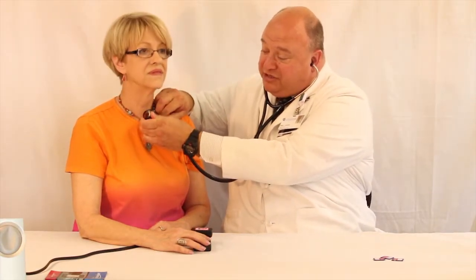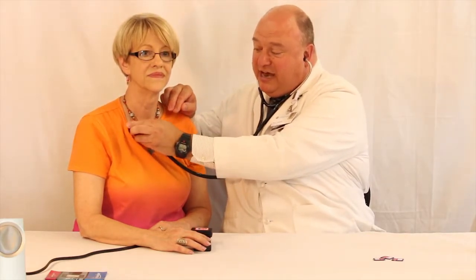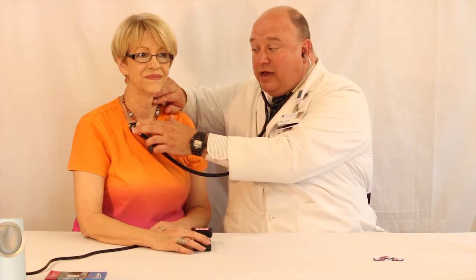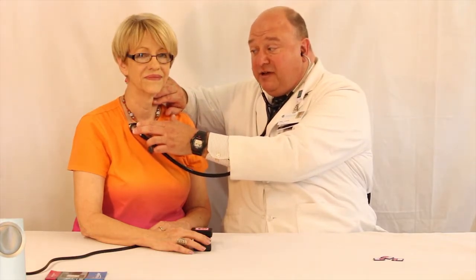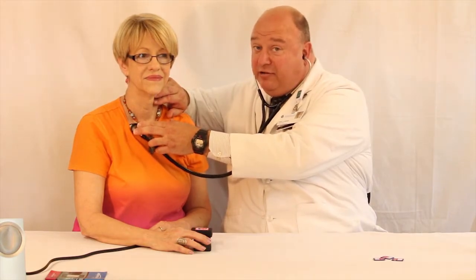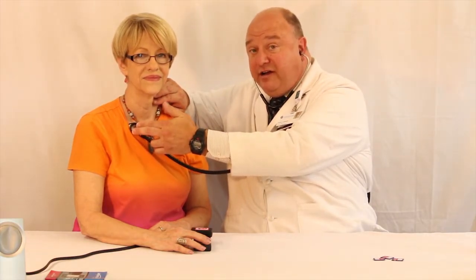Now I go to the other side of the chest. Of course, we would never examine a patient through clothing, and this is not an optimal setting, but for the sake of the video we'll do it this way. What I feel is the first sound, the loud S1, is synchronous with a pulse. And after that, the decrescendo murmur of aortic insufficiency heard only over this area.